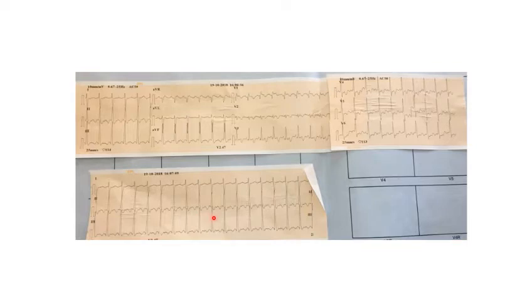See, whenever the heart rate is around 150 constant, or when the heart rate is 75 constant, you should always look for atrial flutter. Because atrial flutter can have a constant 2:1 conduction, that will give rise to a heart rate of 150. It can have 4:1 conduction, which will give rise to a heart rate of 75. So whenever, even on your clinical examination, the heart rate is exactly 75 or exactly 150, always consider the possibility of atrial flutter. Because it is in atrial flutter that you get a constant 150 or constant 75 heart rate. Very often the flutter rate is about 300, and 2:1 or 4:1 conduction is the commonest conduction pattern in atrial flutter, and so they can have a heart rate of 150 or 75. So whenever the heart rate is constant at 150 or 75 on clinical examination, you always think of the possibility of atrial flutter also.